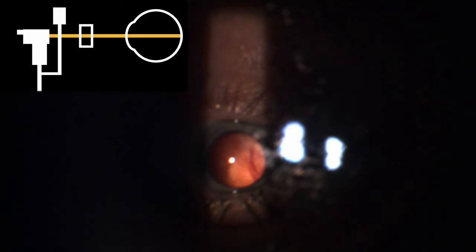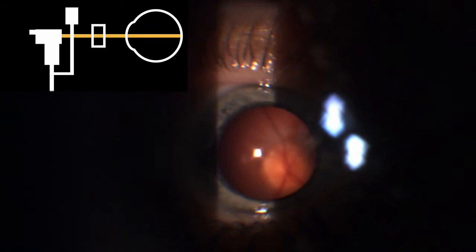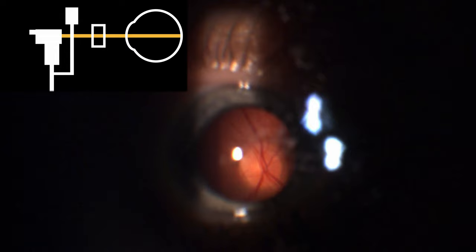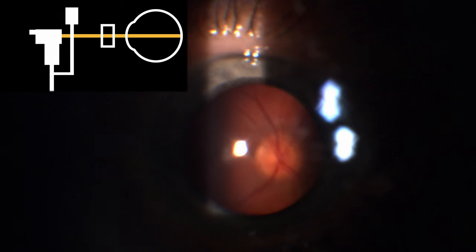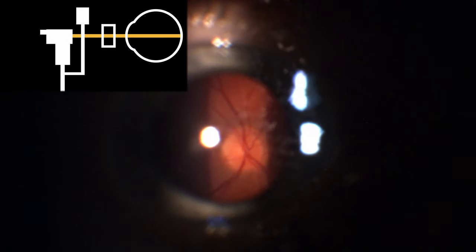Try to move the lens until you see the red reflex but don't move your slit lamp. Beware that everything you see is upside down so this part can be a bit tricky. Once you have a good red reflex move your slit lamp forward carefully until you have a sharp image of a retinal vessel. Then move the lens forward to increase the visible area of the retina. This of course will make your image blurry again. Now follow forward with the slit lamp until the retina is in focus again. Continue this until you have a nice big sharp image of the retina.